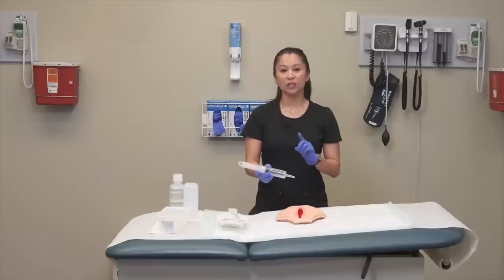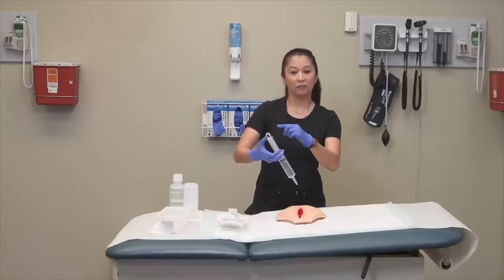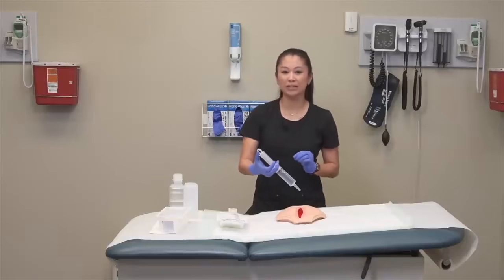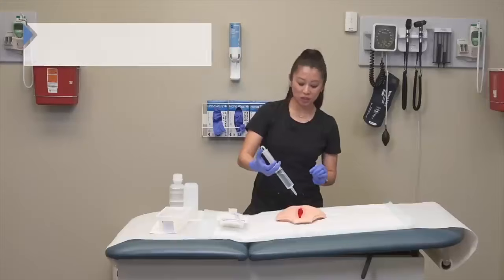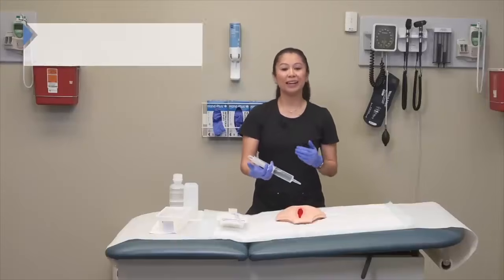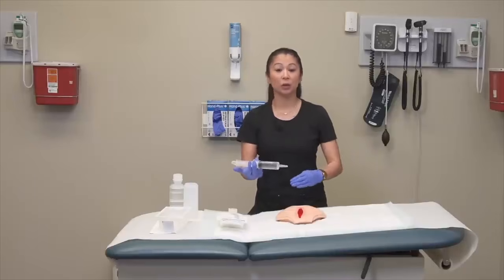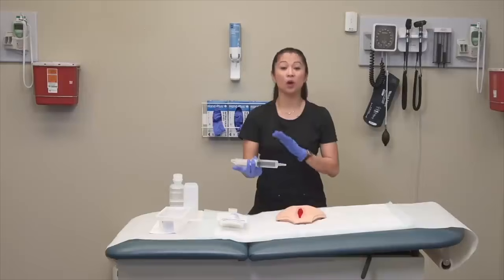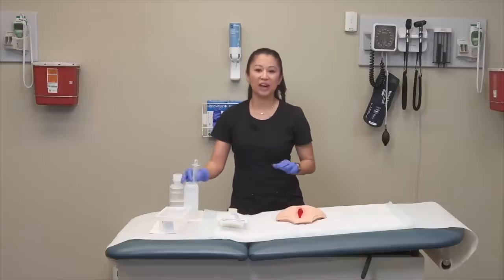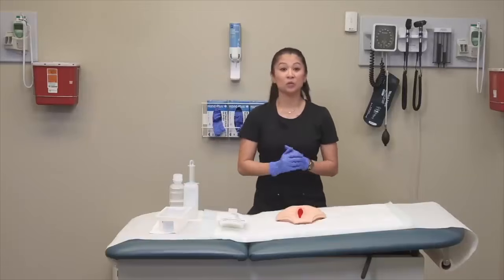Now here's a tip when you irrigate: when I'm pushing down on the plunger, the faster I push down, the more force that's going to go into that wound, and that can be really uncomfortable. So a good tip is just to gently push down and see how the patient tolerates that. And again, you may have to repeat this as necessary. Using the syringe, you're going to go from the clean areas to the dirty areas until all of those are addressed. If I was using a basin, all of that would fall into our basin for us. And again, you may need to irrigate a few times.